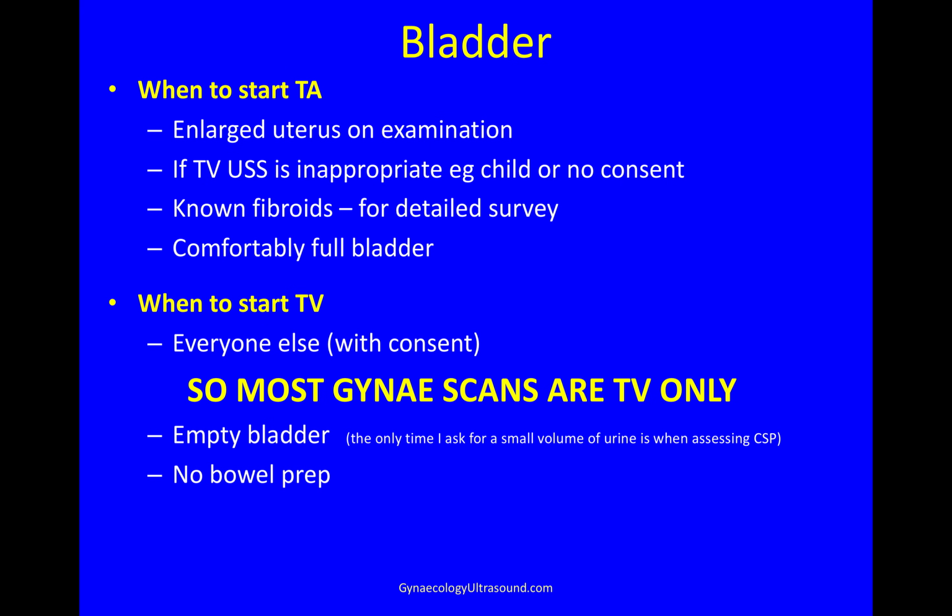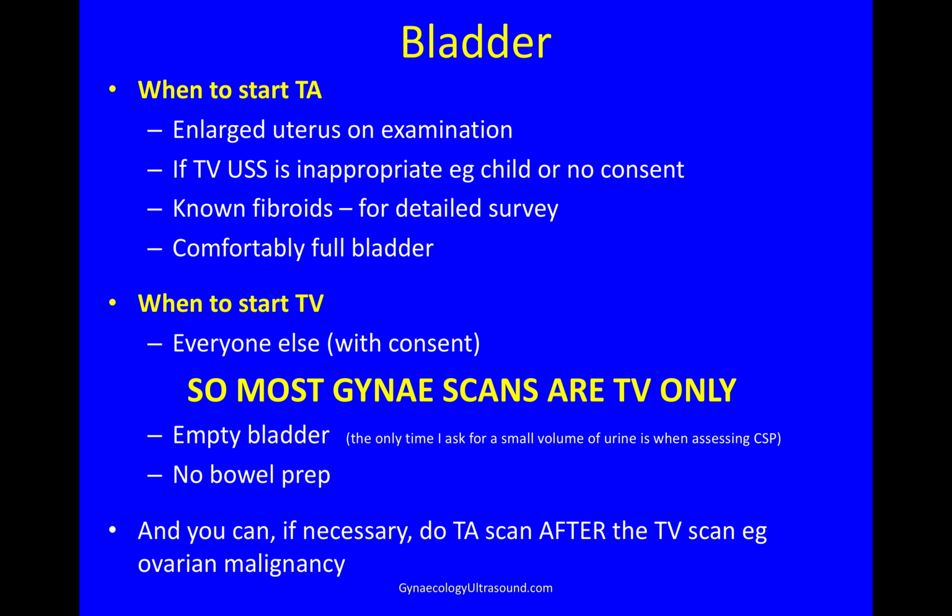And you start the examination with the patient having emptied her bladder and no bowel prep. You can, if necessary, do the transabdominal scan after the TV scan, for instance, in case of ovarian malignancy, to assess potential masses and metastases better transabdominally.